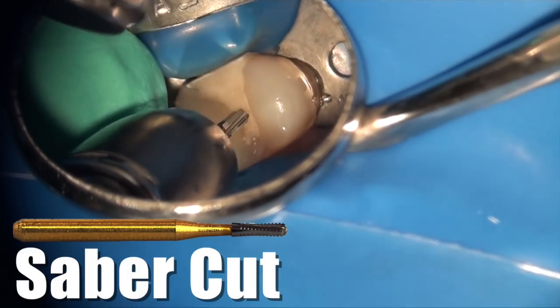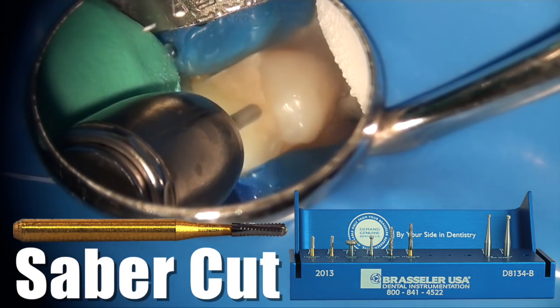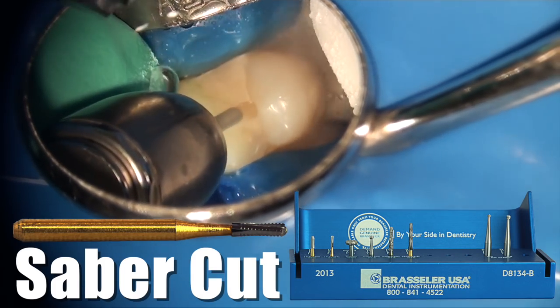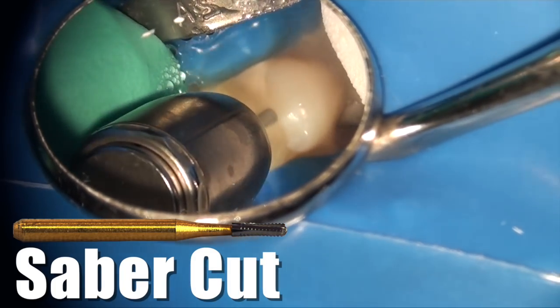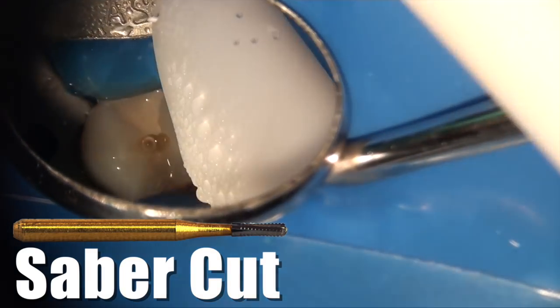We proceed to take the saber cut bur from our Rewaldendo access kit and create our outline form. The saber cut is a very efficient bur and as you can see, using the Forza electric handpiece here, it cuts like butter basically.